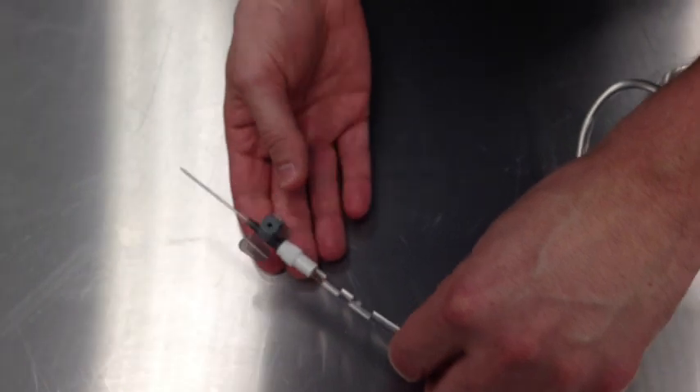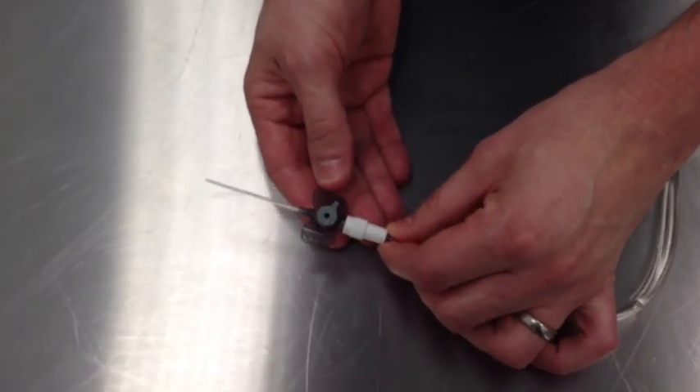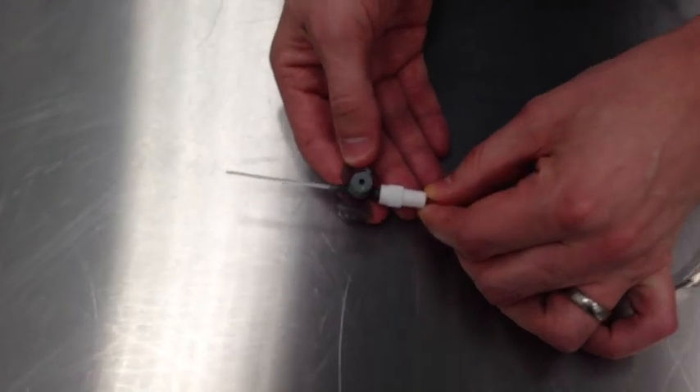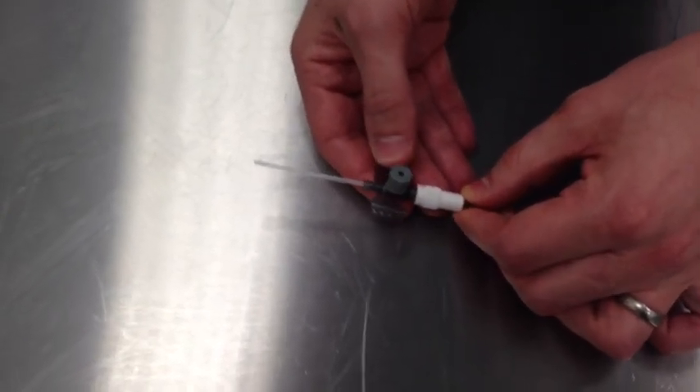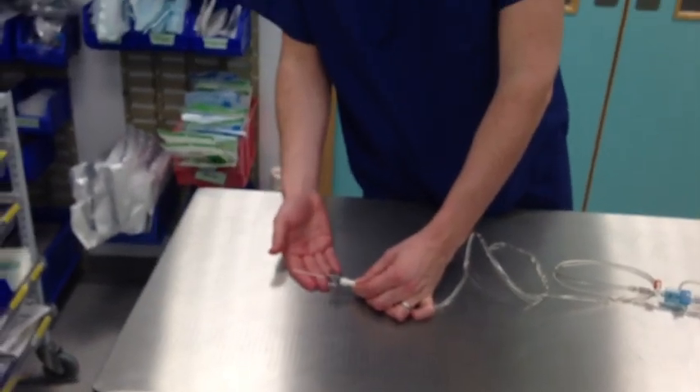Following it down to the cannula itself, we can see that this is a cannula for intravenous use, specifically a 16-gauge intravenous cannula. Another abnormality is that there is no patient attached to the cannula itself.